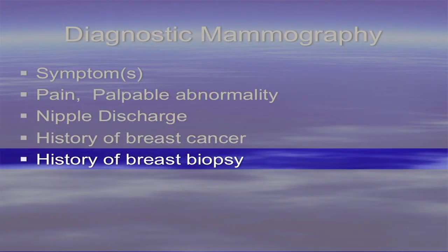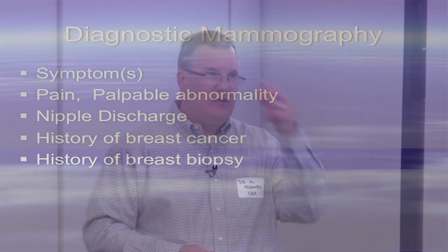Sometimes, like I said, you had a history of a breast biopsy and it turned out to be fat necrosis, somebody still might be a little worried, does he really know what he's talking about, saying this is fat necrosis, and he says recommend follow-up in a year? They still might recommend a diagnostic mammogram in a year. And we look at it and we say, oh yeah, there it is, stable. See you in a year.